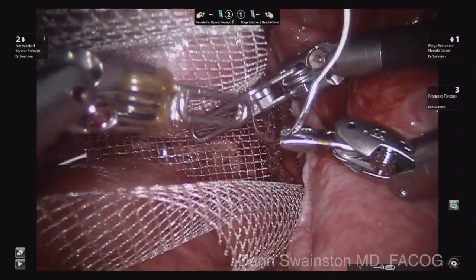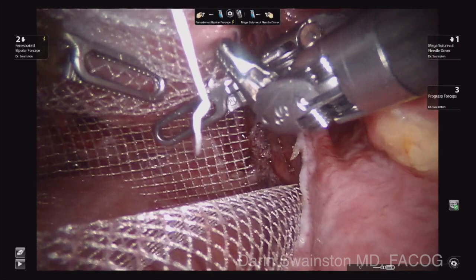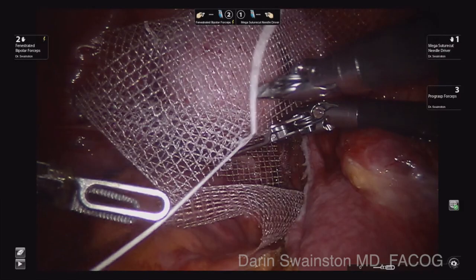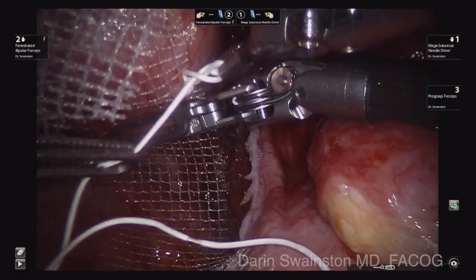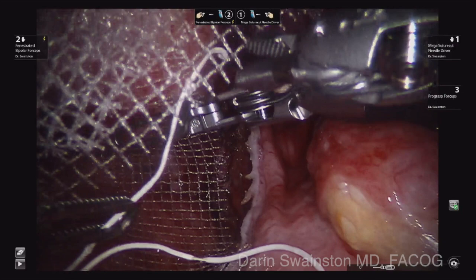I am making sure that is in the right location, right tension, and then I will place that suture. It is nice if you can go right through the mesh on both sides, but just capturing the edge is fine as well. You are really trying to tack this down so that the tissues will grow into the mesh — that is why these mesh products are super lightweight and have large pores. This particular mesh is called Coloplast. I really like this mesh because of how soft it is. The upper arm is thinner so it is easy to see which part attaches to the sacrum. It is wide enough to have plenty of mesh and long enough to have a nice Y above the apex.